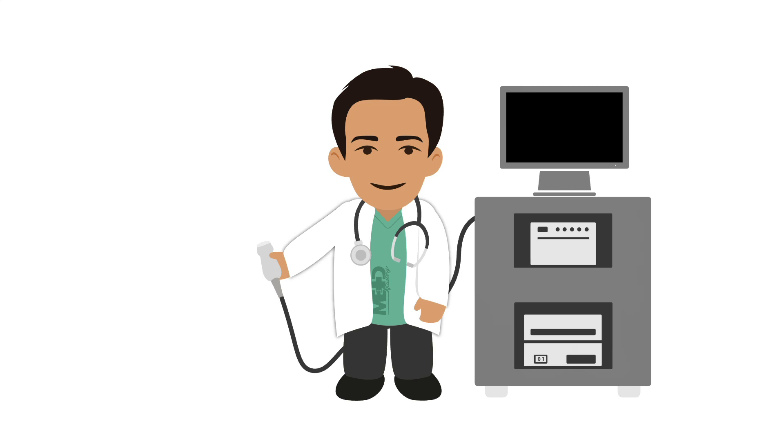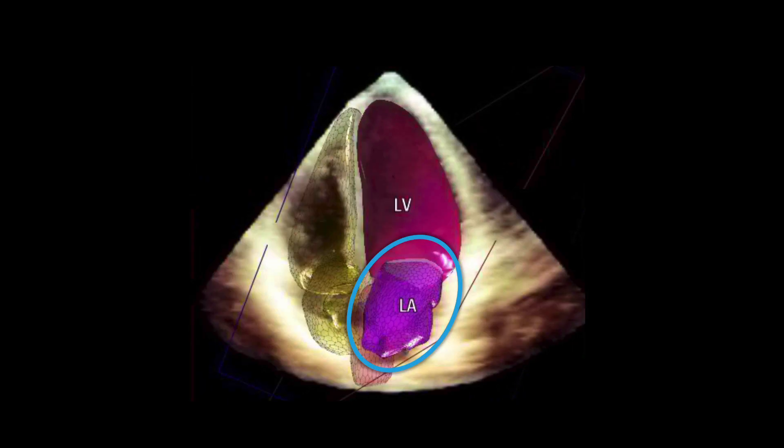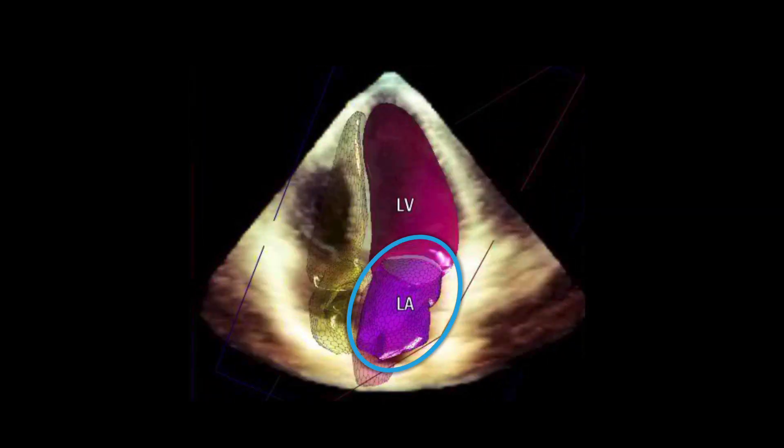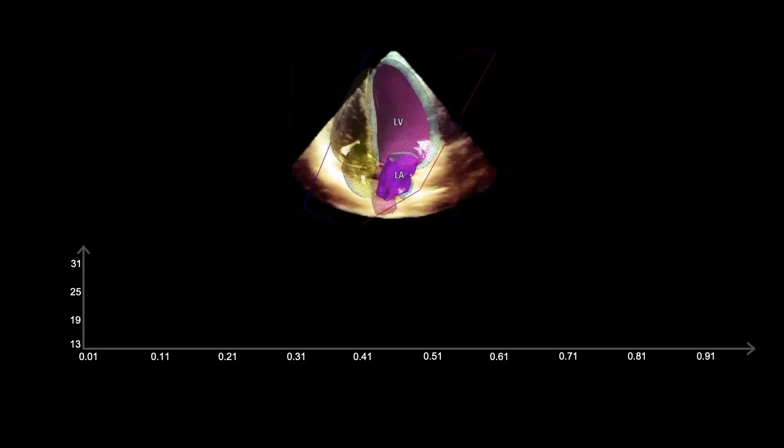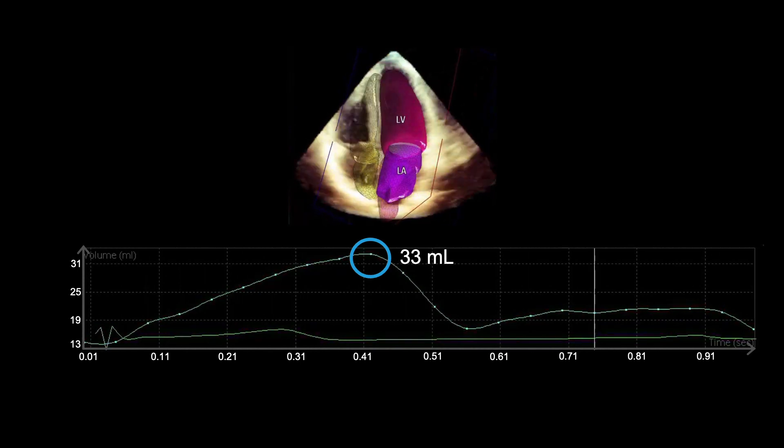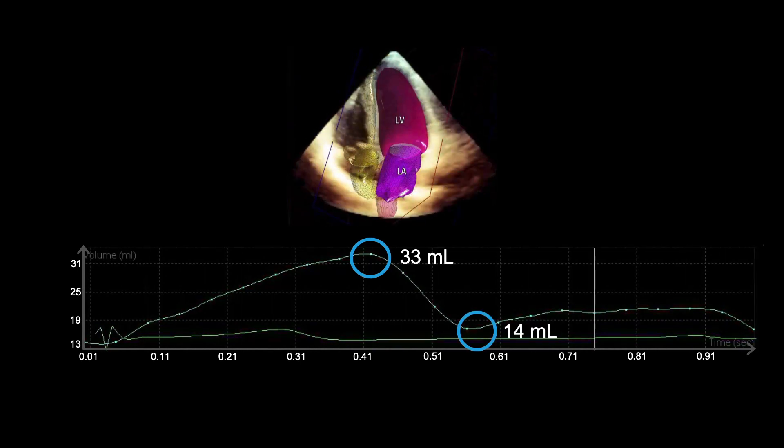Let's look at how we assess left atrial dilatation in 3D echo. Left atrial size can be appreciated with 3D imaging continuously throughout the cardiac cycle. The left ventricle can also be seen here. Here you can see the left atrium has a maximum volume of 33 milliliters and a minimum volume of 14 milliliters.